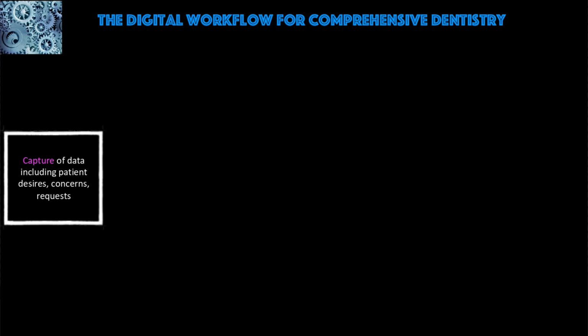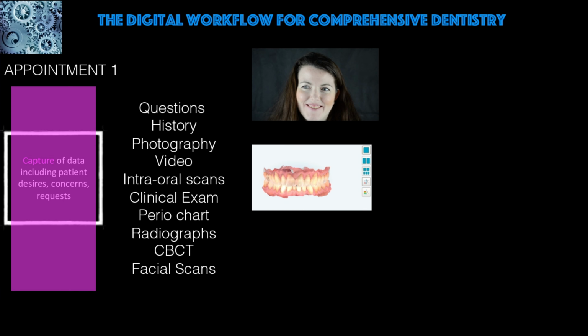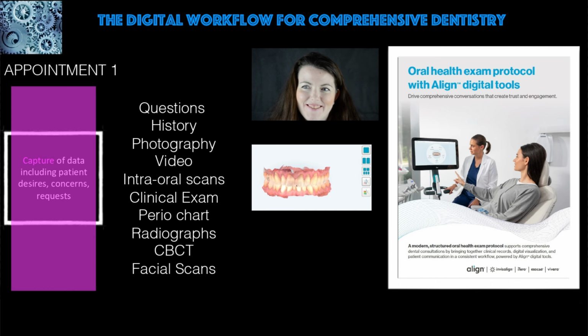And I think when we start thinking about it a bit like Christian's slides, there's a lot here that isn't typical of how we used to see patients historically. And even the skills that we need to leverage all the technology, to take facial scans, to take videos. If you're working with dentists as technicians, coaching them through what's an acceptable photograph and what isn't an acceptable photograph. How, if you're the person doing the planning and the imaging, you need that data presented to you in a way that's usable, not just any old photographs taken from any old angle.